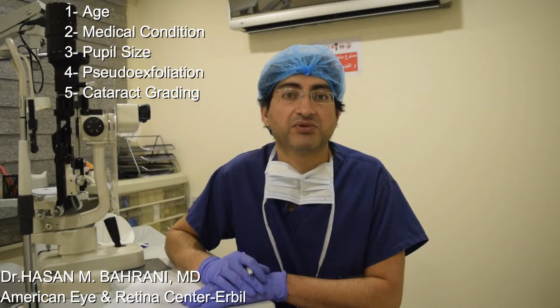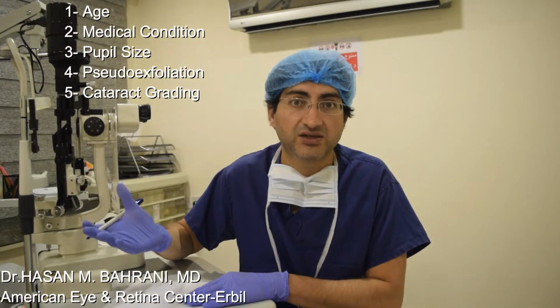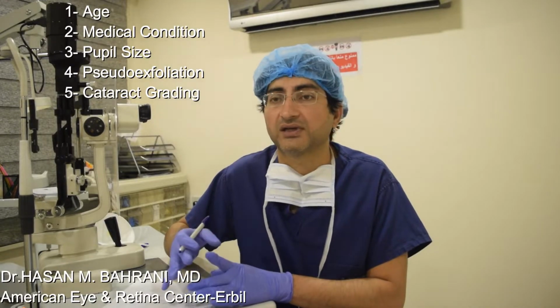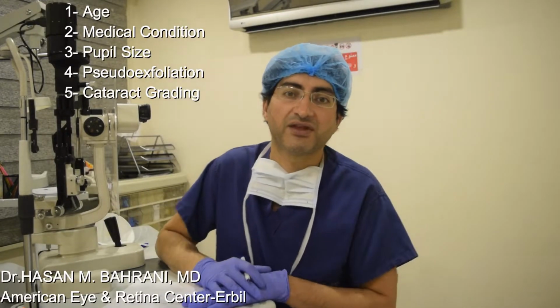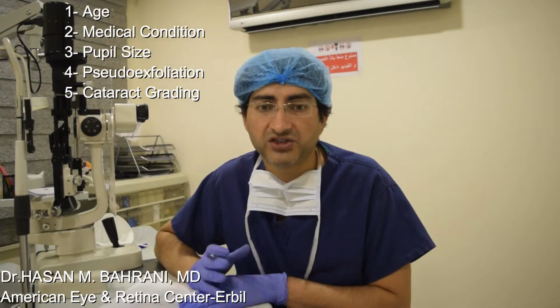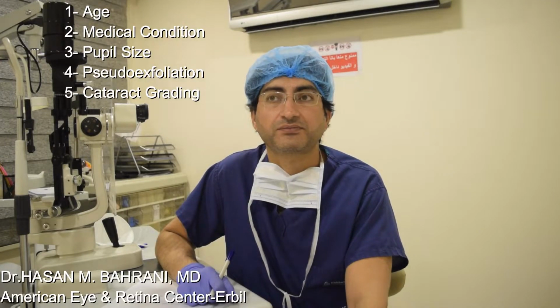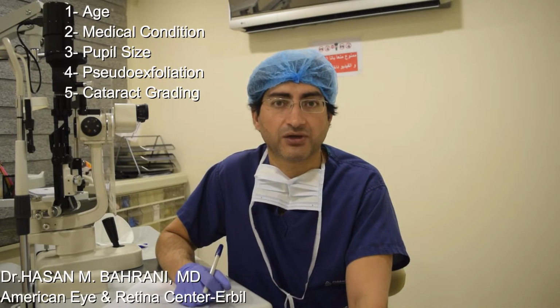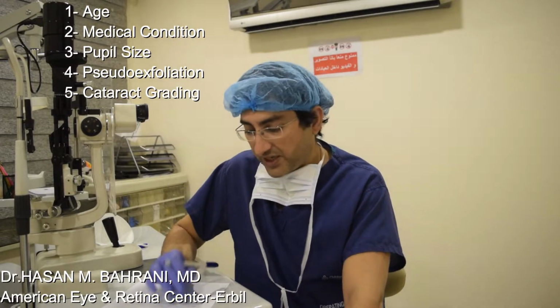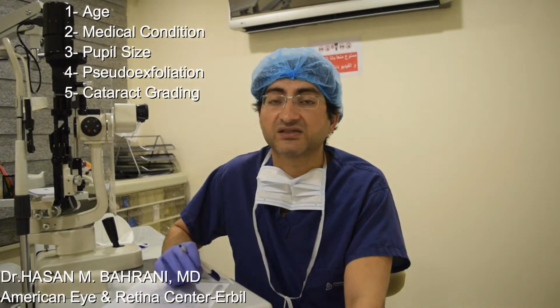You probably want to give that to a more experienced surgeon or your senior resident, because you probably need to use an iris hook, Malyugin ring, or anything that may help you dilate that pupil, or you may just want to stretch that pupil with the wide hook and the Lester hook. But pupil size is important to write down. The presence or absence of pseudoexfoliation is extremely important.